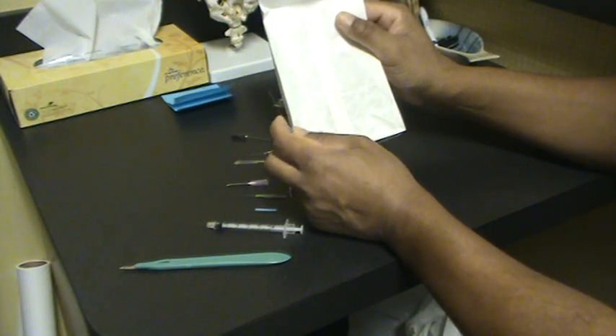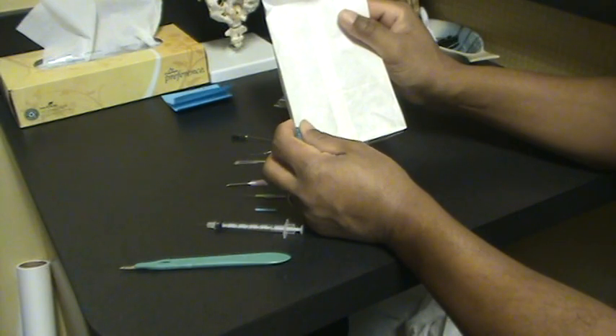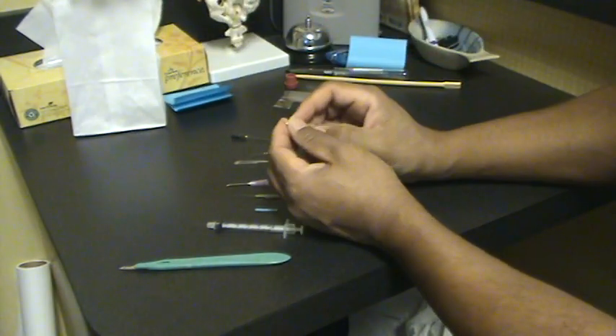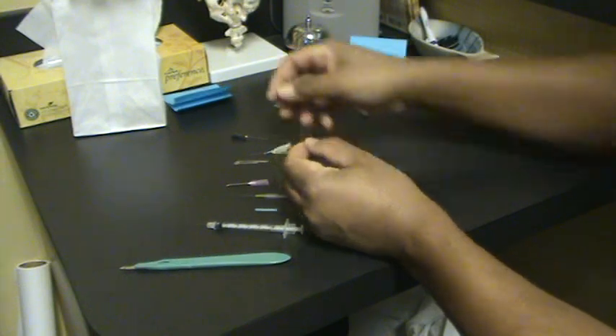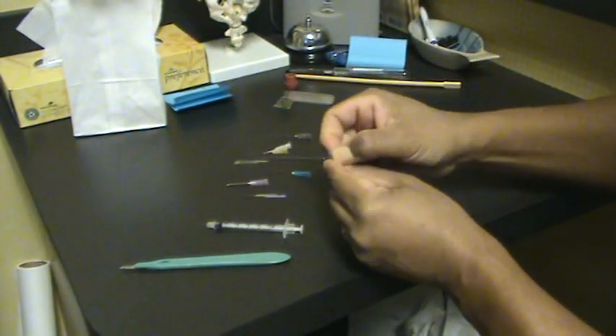The rebooted muscle will be a lot more flexible, limber, and cooperative. All these are different tools. This is an acupuncture needle.